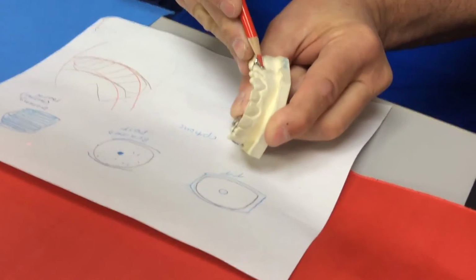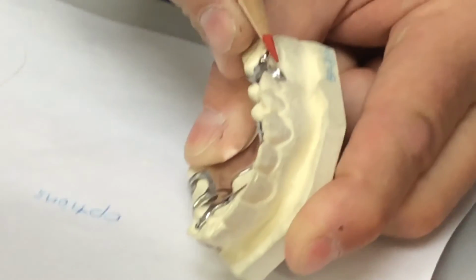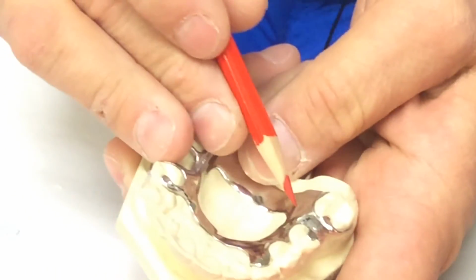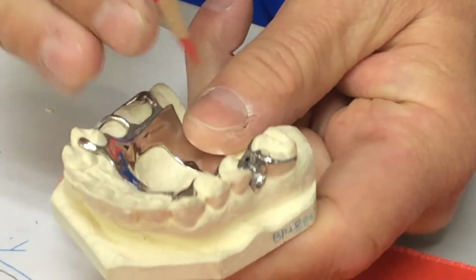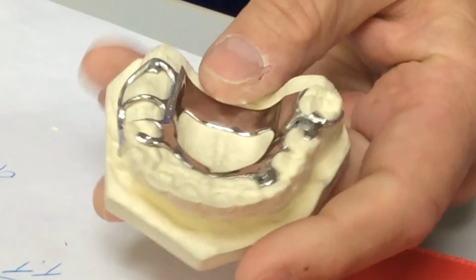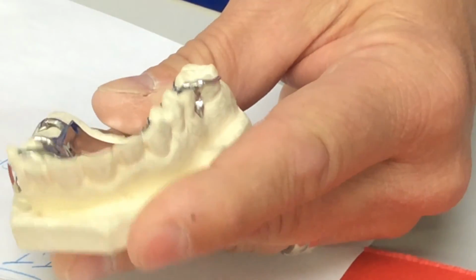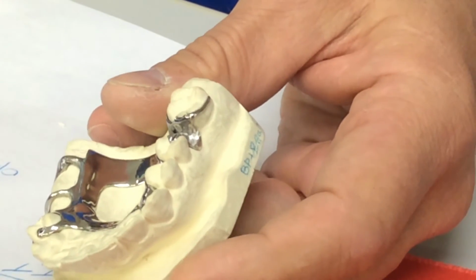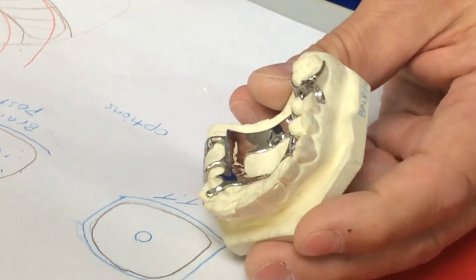And you will still have a metal band out here that goes around that tooth, and this metal band on the inside that goes around the tooth, and the tooth will actually be glued into that space. It looks like the tooth is coming right out of the metal. There really, on a tube tooth, is generally not any acrylic. You would have to specially order that you want acrylic there if you're wanting it.